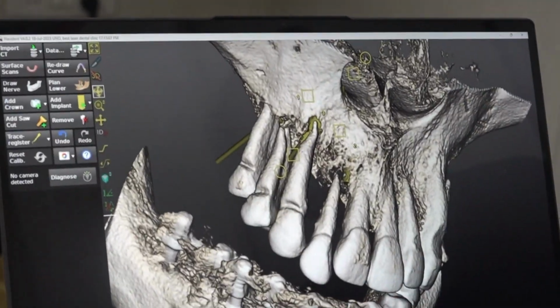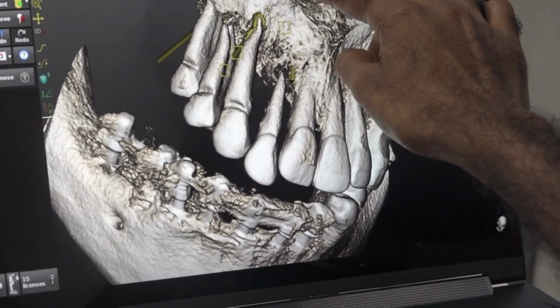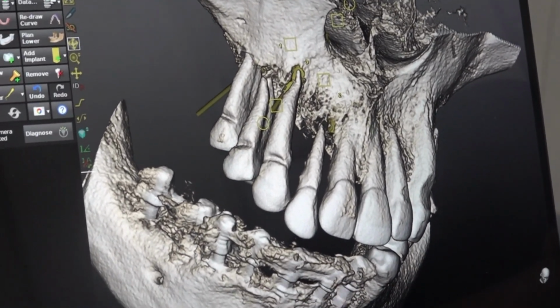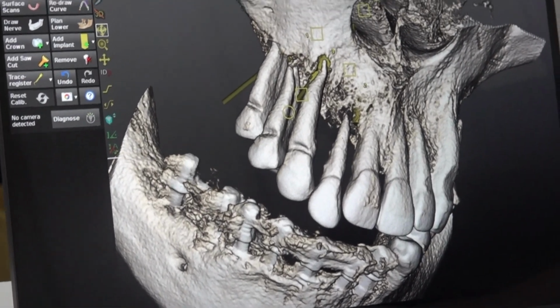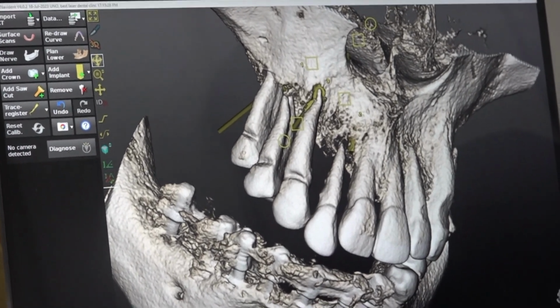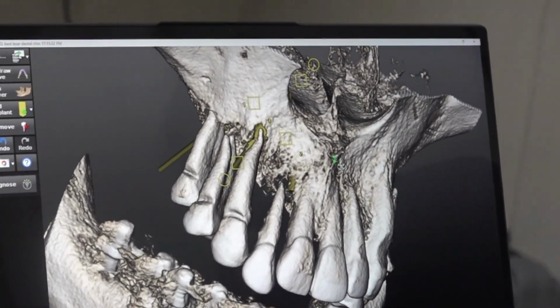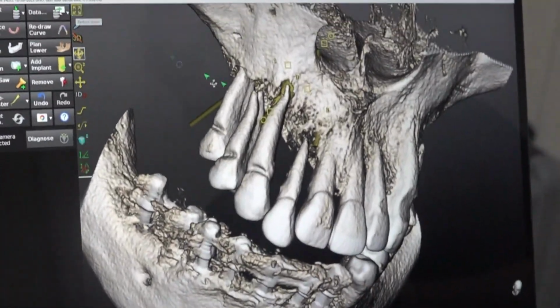You should open the flap and see. So when you are drilling, you will come closer to the labial aspect. So for full mouth, opening the flap only is not enough. You have to open till the nasal floor. Sometimes in these kinds of tight situations you can open till the nasal floor. You have to expose this little bit of nasomaxillary buttress. Nothing wrong in it. Okay, so totally 3 implants.